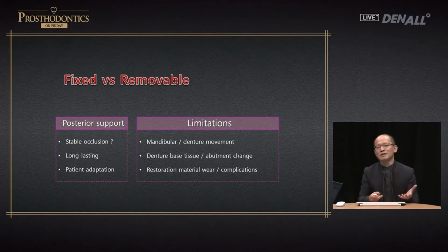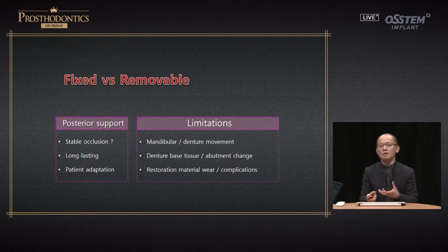In terms of how you do rehabilitation, are you going to use fixed or removable? Using implants for the full mouth, you could do fixed or removable, but prognosis will be different, and also cost-wise.